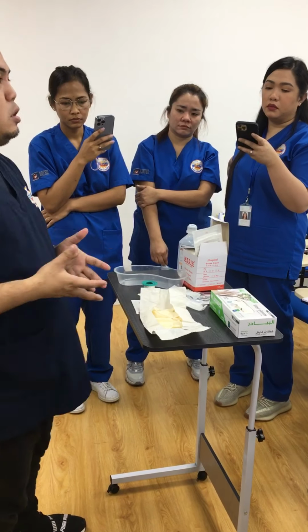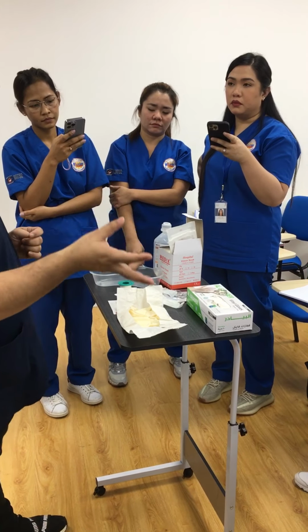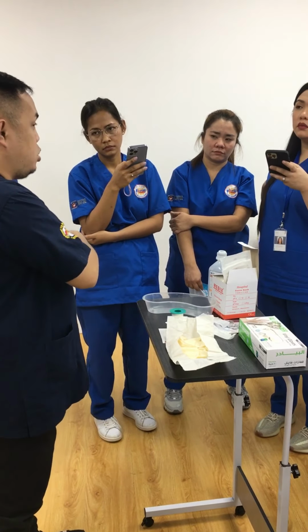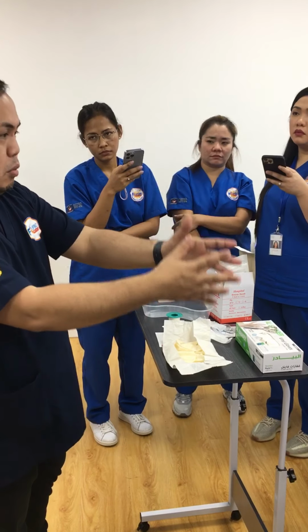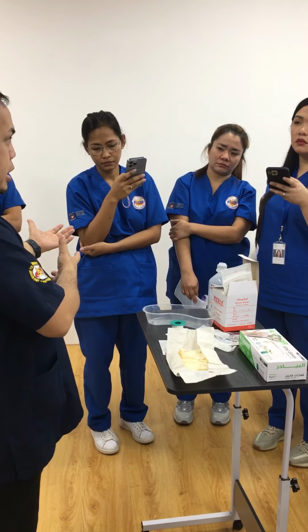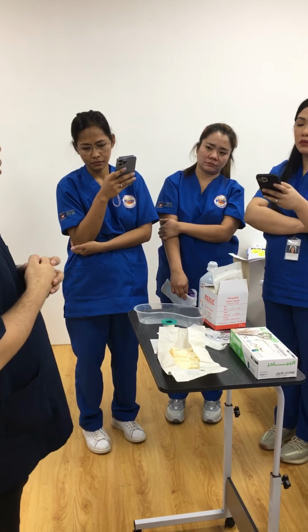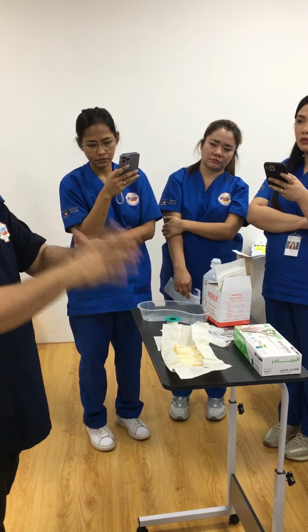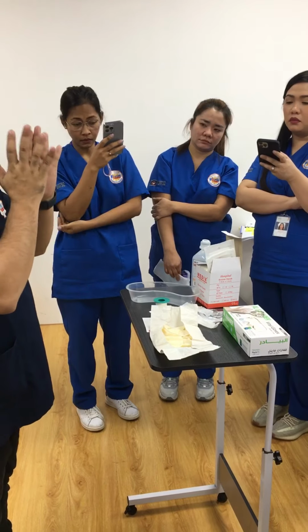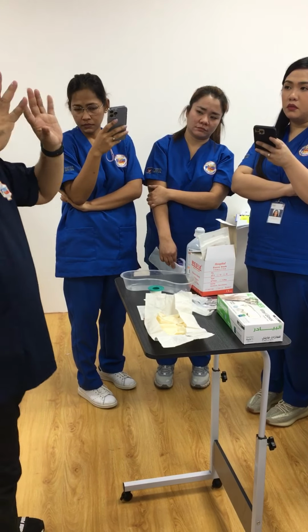Okay, so we have to observe an aseptic technique or a sterile technique. This is sterile clean technique. So the concept of sterile technique is sterile plus sterile is equals to sterile. So if you are sterile, you are only allowed to touch a sterile part. If you are unsterile, you're only allowed to touch unsterile part. Kung malinis ka, malinis lang dapat yung area or part na i-touch mo. Pero kung yung kamay mo hindi naman malinis, dapat yung part lang ng gloves is the unsterile part. So if my hands are considered unsterile, even though I do hand washing, still it is unsterile.